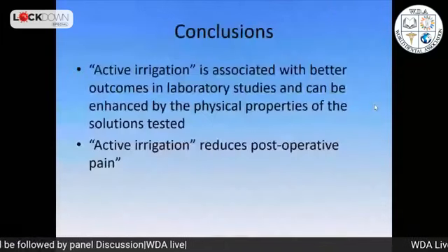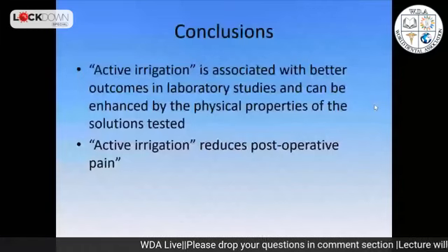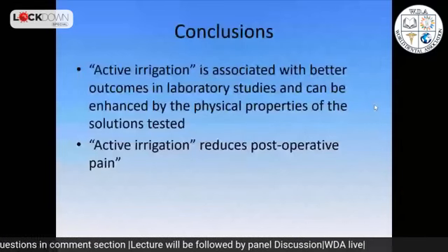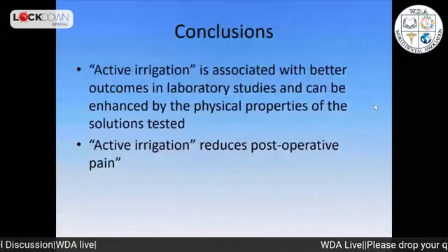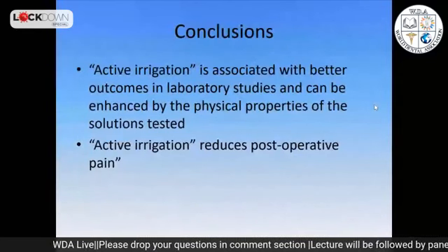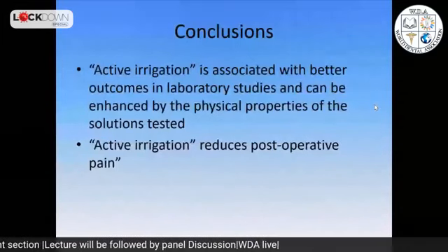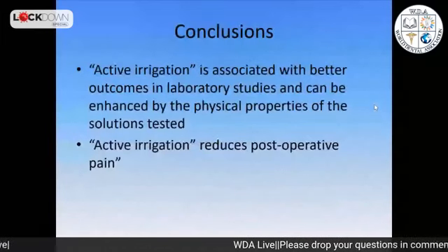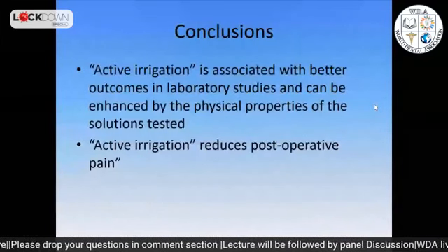So with this, I would like to conclude saying that, from the laboratory studies, there are no doubts that agitating your root canal irrigant makes a big difference. Everything is a lot better. There will be a lot of contrast between sonic and ultrasonic, but agitate, please. And we have evidence that tells us that patients will have less pain if we do a good agitation. Of course, everything needs to be done carefully. We don't want irrigant going through the apex. We need to protect our patients. Okay, so agitate, but with care.